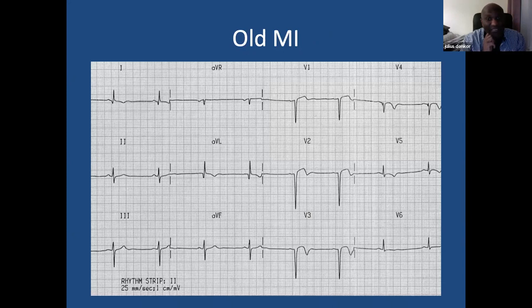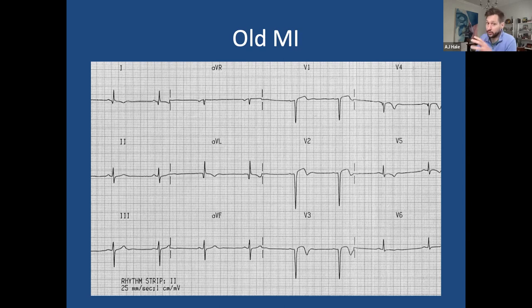So it's an old anterior MI with an L, which has obviously ended up being aneurysmal from that. How old, sorry, I don't do caths at all. So how old are we talking about here? Anything more than 2 weeks is old.